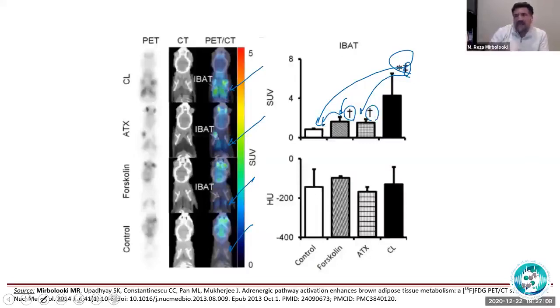The thing that we learned from here, because we get different levels of activation, is that we can call it severe activation or moderate activation. So it kind of gives us a range. So this gives us lots of tools to actually work with.